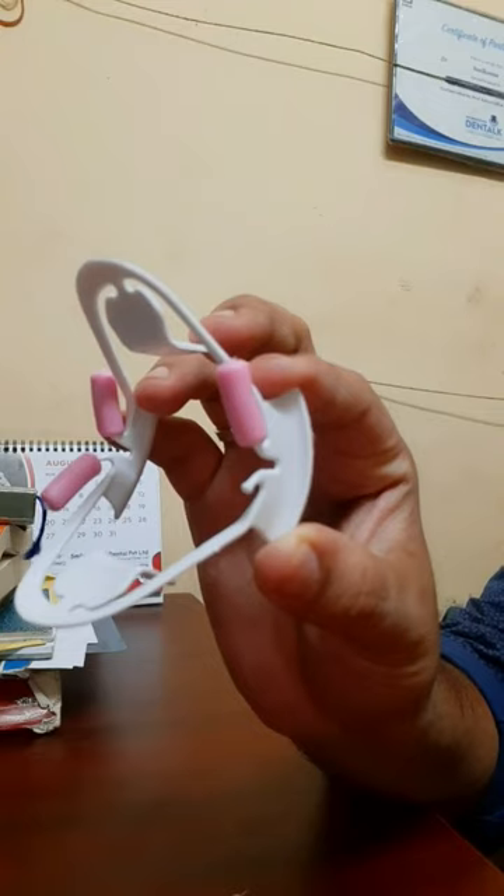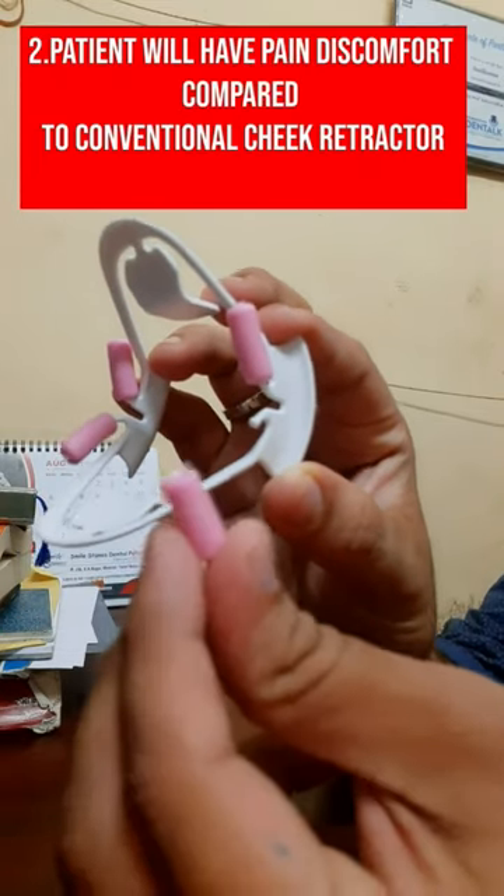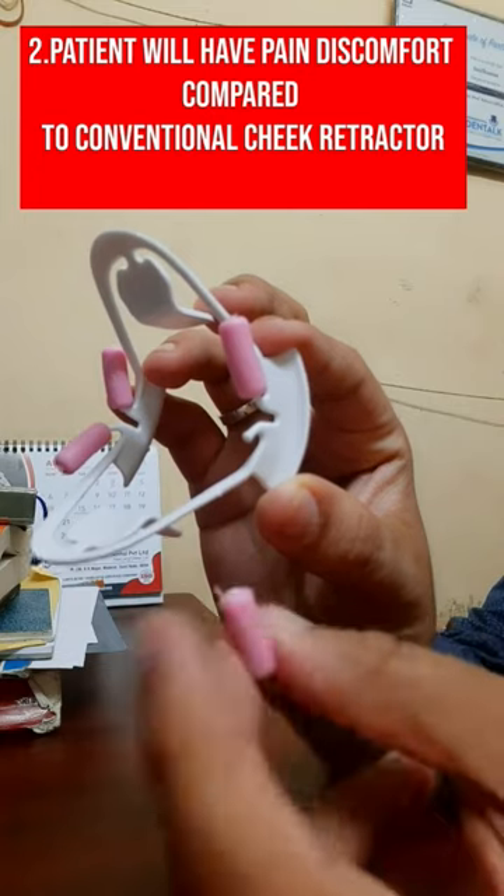Second problem: the patient has pain and discomfort compared to the conventional cheek retractor. Somehow I am managing to use this 3D cheek retractor in patients, but it is a notable issue.